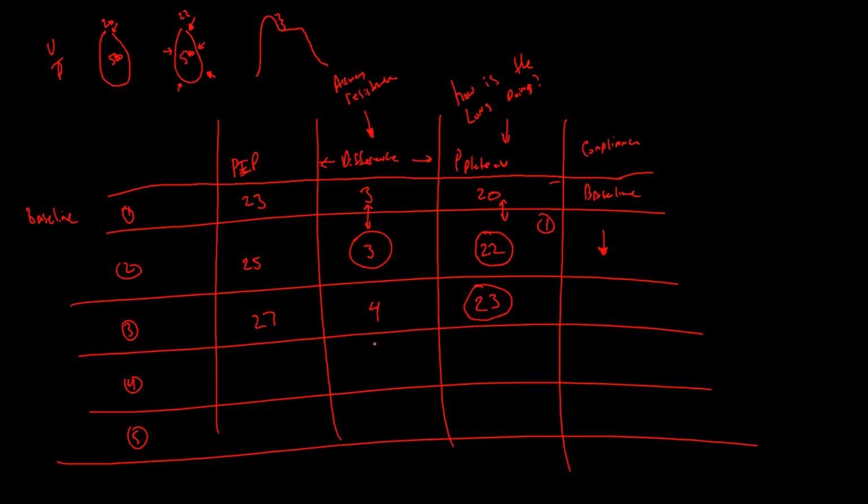So, Tamisha, is the airway resistance getting less, more, or staying the same? Air resistance. No, it's not the same. I would say more. Okay, why are you saying more? Because I can tell by your voice that's a guess. Okay, it's more just because we're comparing this number. That's literally all we're doing is comparing these numbers.